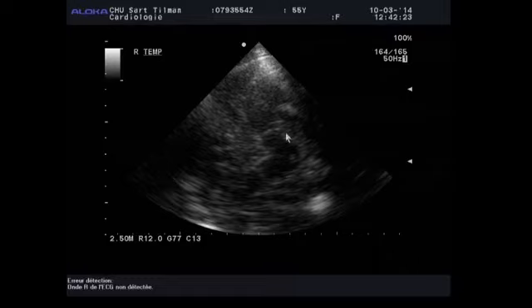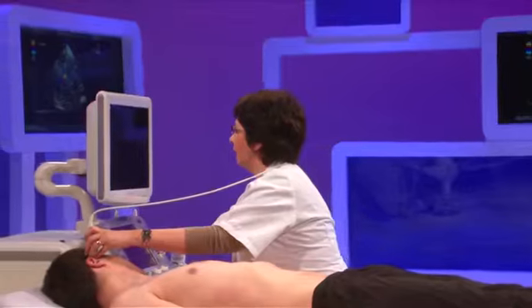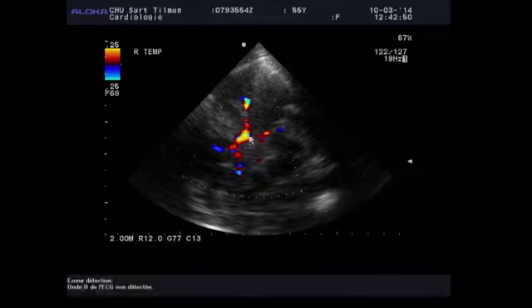And you must try to find this little butterfly, which is the cerebral peduncles here. And then you have the circle of Willis here, with the middle cerebral artery here, the posterior cerebral artery here, the first segment of the anterior cerebral artery here.